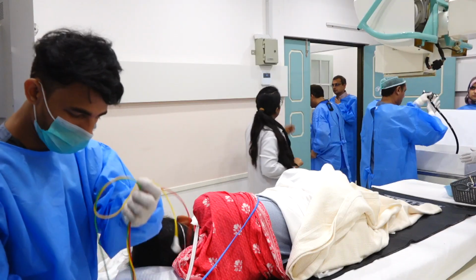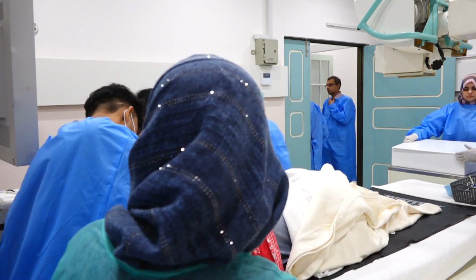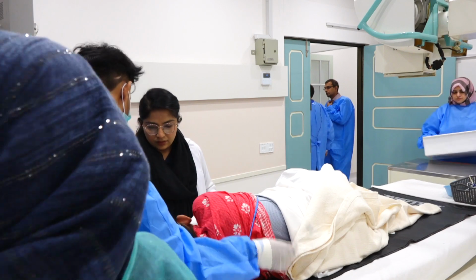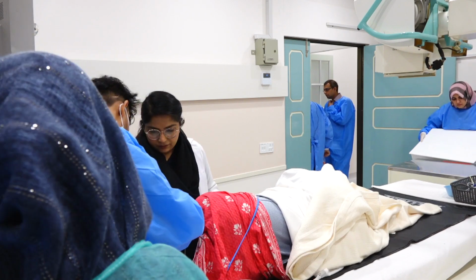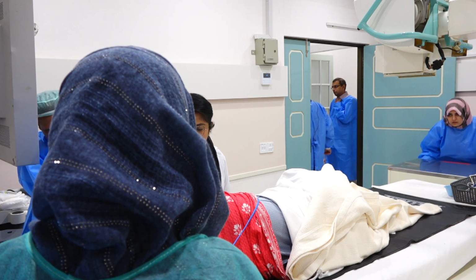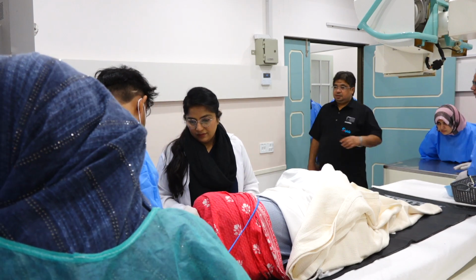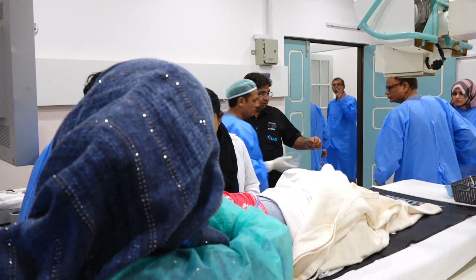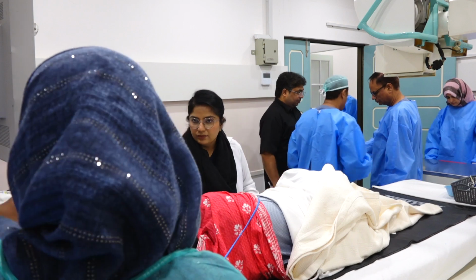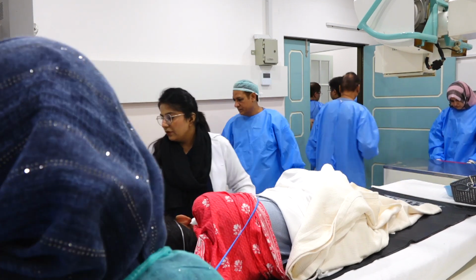How can on EUS we differentiate between air bubbles and stones? No, I think, yeah, I don't even see a major stricture. Dr. Hassan, if it is a stricture, it's fibrotic or inflammatory, with stones and air in the bile duct and with the stent. So I think we just need to dilate it. Yeah, pretty much. Dilate, take the stent out, dilate it, and then just clean out.